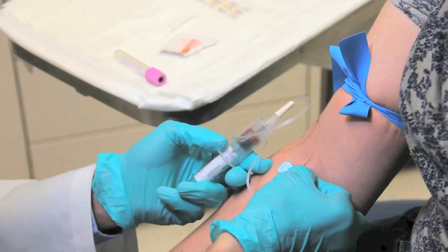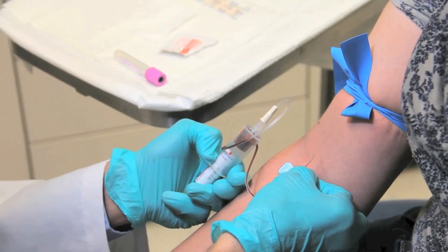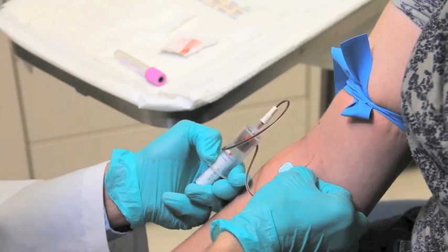First, if your hands are big enough, grasp the tube with your pinky and the adapter with your thumb and index finger. With the vacutainer within the adapter, apply pressure to the tube and allow the stopper to pierce the seal.